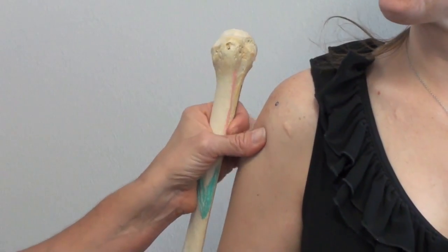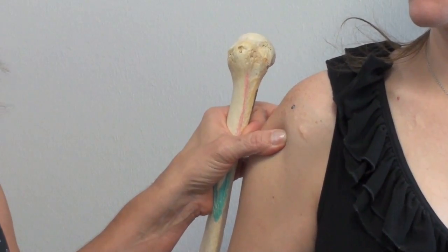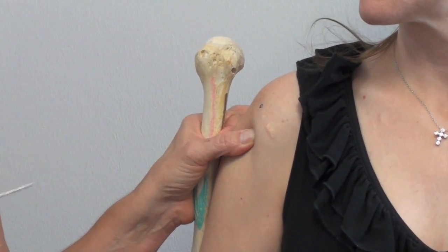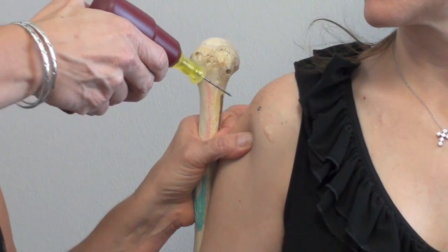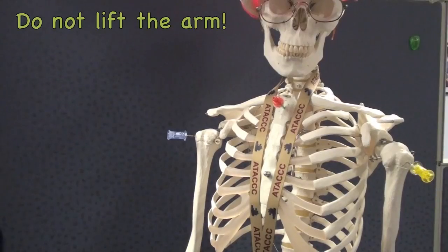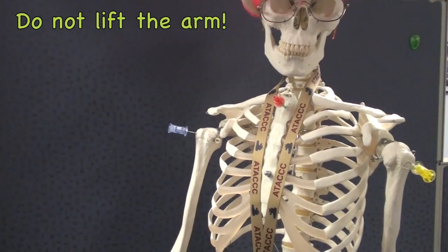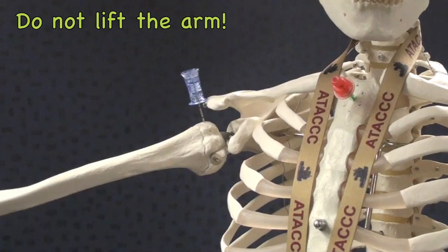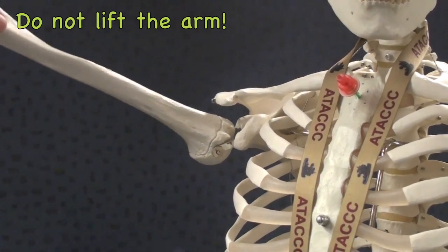Once we locate our insertion point, we want to take an insertion angle of about 90 degrees to the skin — at this point it would go in at about that angle. What if you do lift the arm? As the arm comes up, the EZ-IO impinges on the acromion and pops right out.